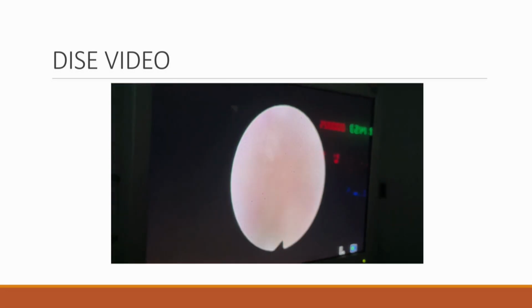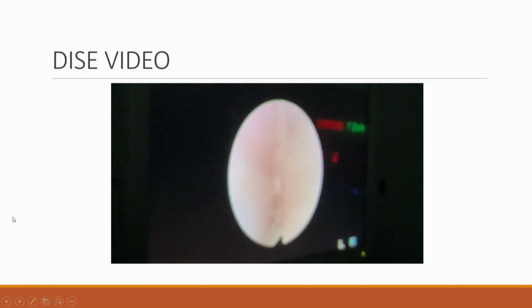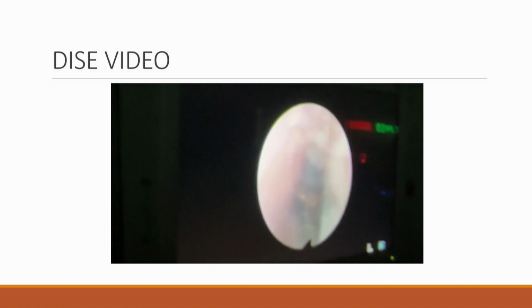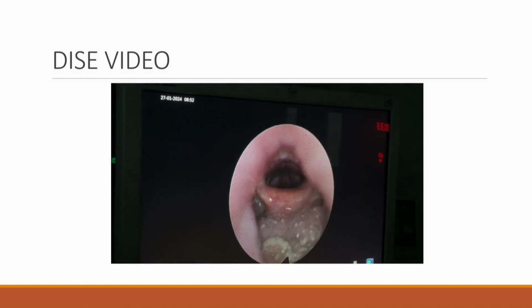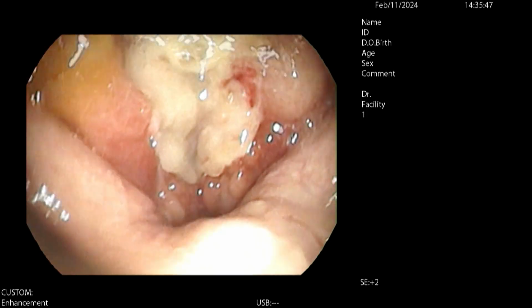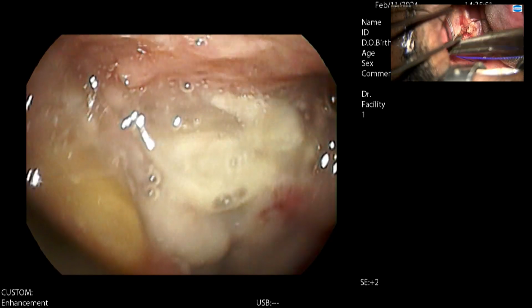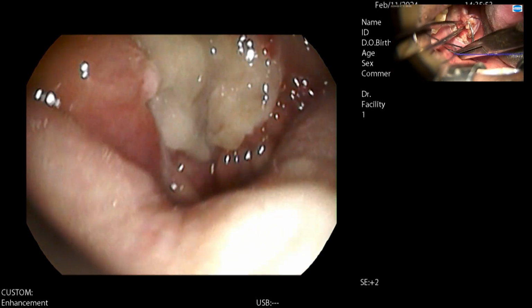Yeah, we will show that DISE later, but now shall I just show the DISE as it is right now, because the patient is snoring very severely. We have already done a turbinoplasty and the adenoid. Can you shift the OT please? Audiovisual. So this is the adenoid we just did 2 weeks back.